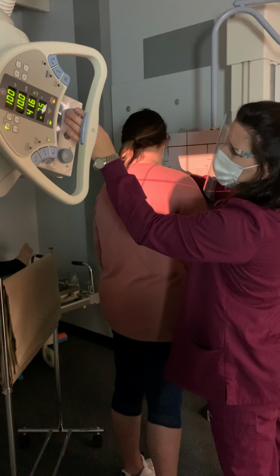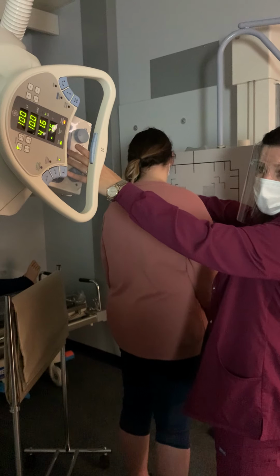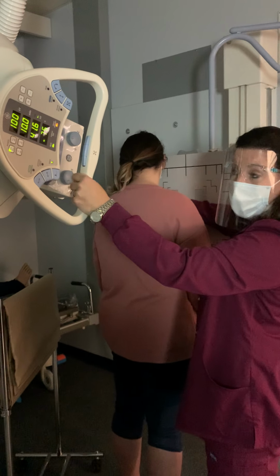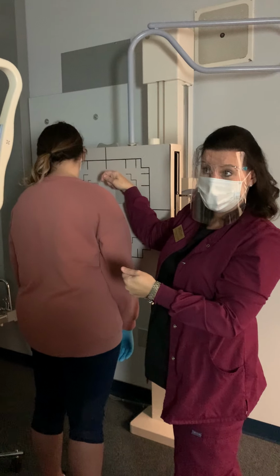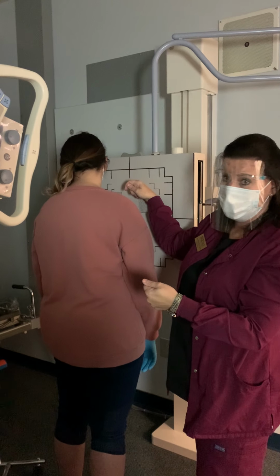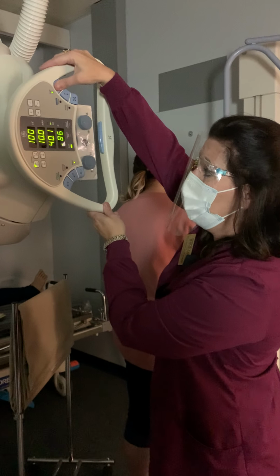Oh, another thing I need to tell y'all, when this tube is angled, the collimation is off. So therefore, you need to go ahead and set your collimation before you angle the tube and then angle it. What would the collimation be with it angled? I don't know. Go ahead and set it.